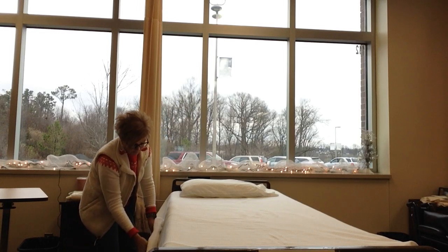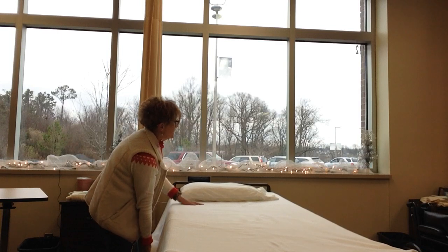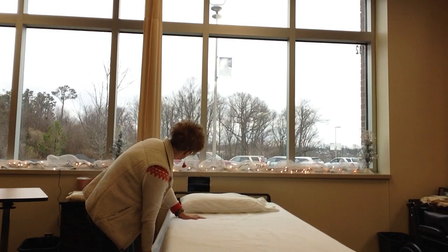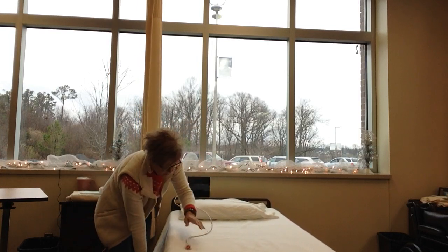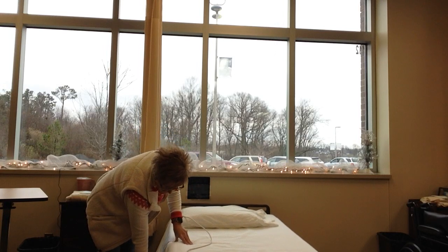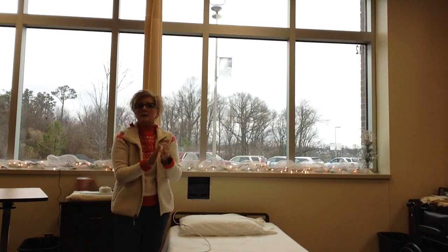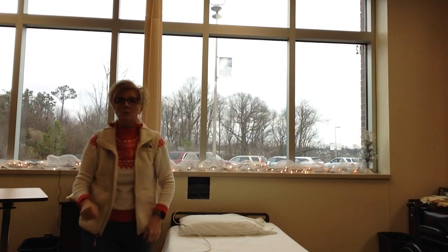Now we're going to lower the bed to the lowest position. We're going to make sure that the resident has access to their call light. They have their call light. I'm going to wash my hands and report and record.